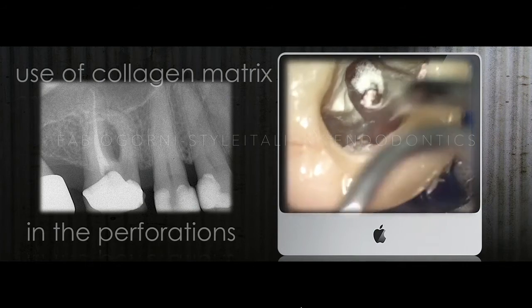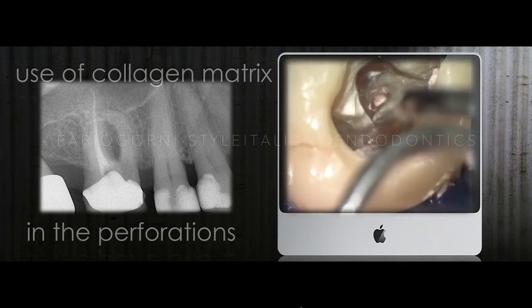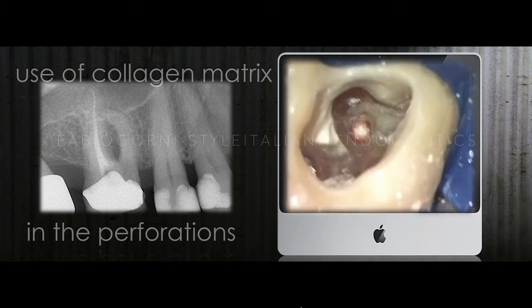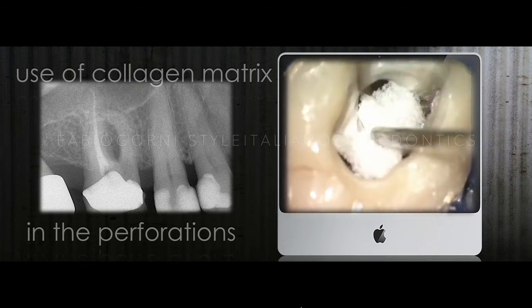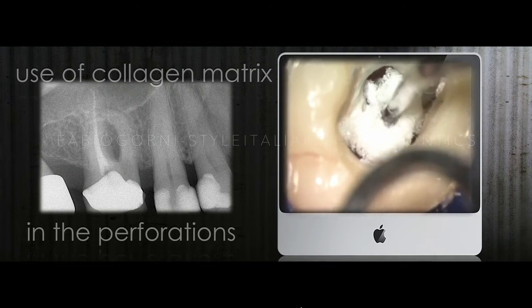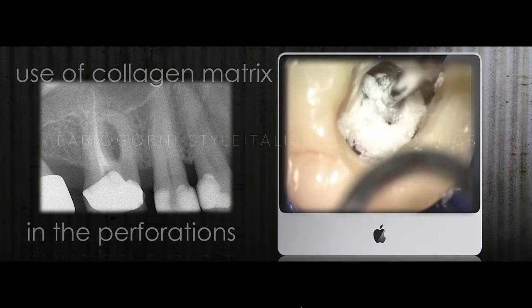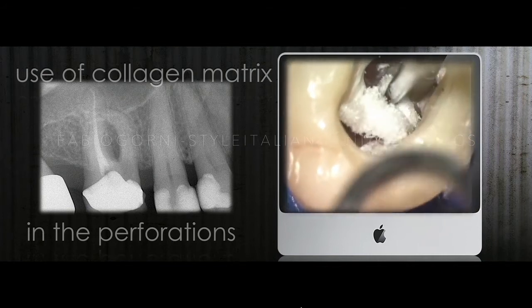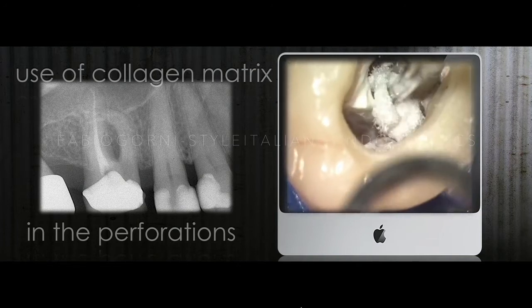Don't worry about pushing material outside. It is a completely resorbable material, and in this case it is much more important to control the MTA later. With the collagen barrier, we can also control the exudation, especially when we have an active exudation.